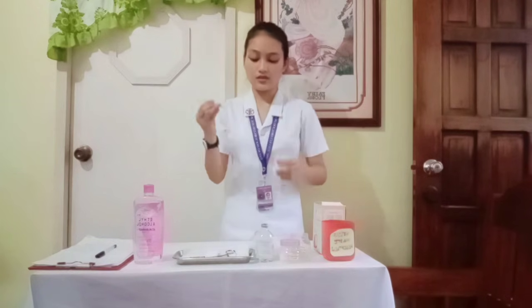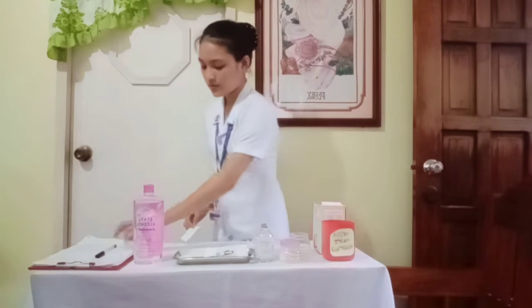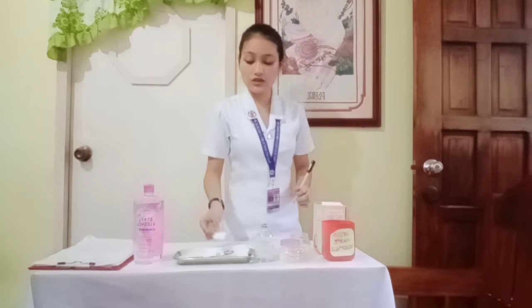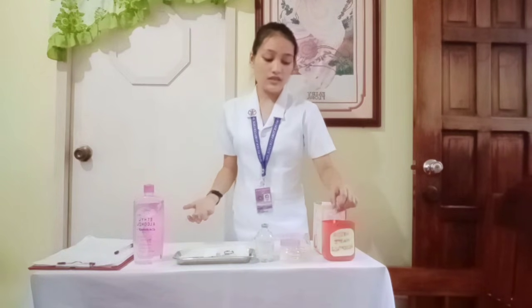Now place this syringe into the hypodermic tray. Write in the medication ticket the name of the drug and dosage, of course. Now place the medication ticket also in the hypodermic tray and discard the used aspirating needle into the waste receptacle in order to avoid needle prick injuries.